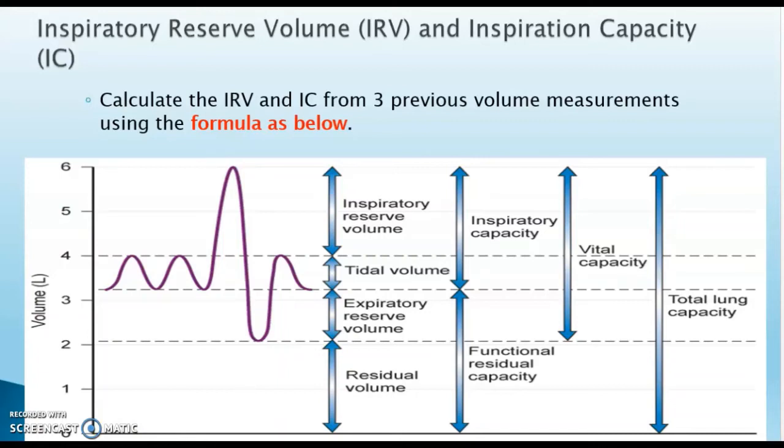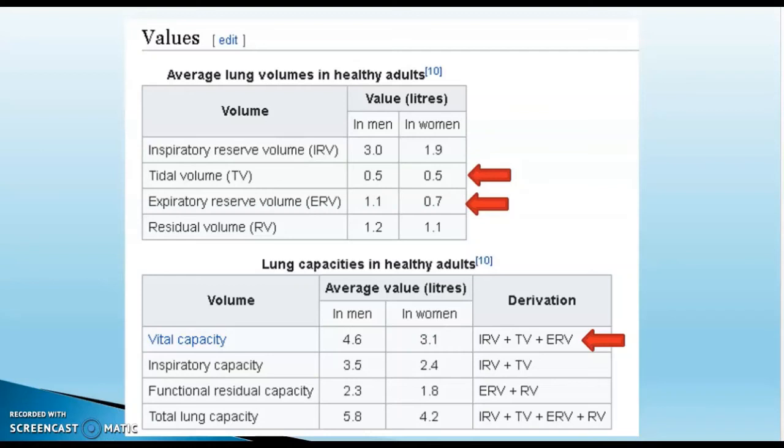And the last type of human respiratory volume that could be measured using a spirometer is the vital capacity. Vital capacity is the maximum amount of air that can be exhaled after the fullest inspiration possible. Human respiratory volume is usually measured in cubic centimeters or in liters.